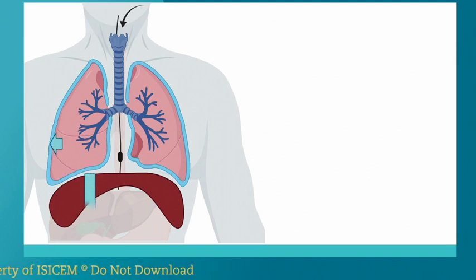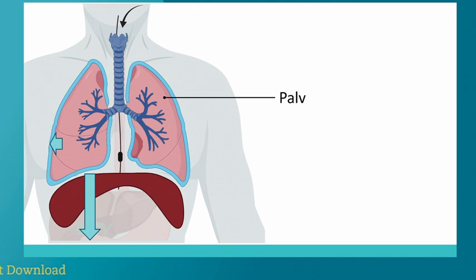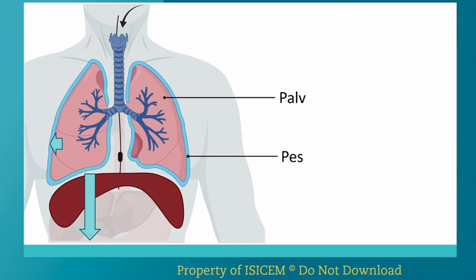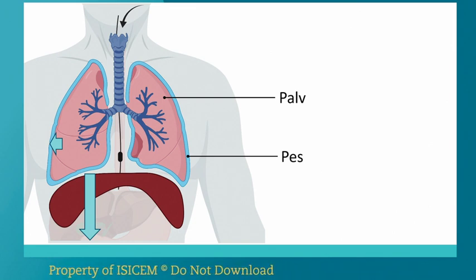So we're worried about lung distending pressure and the magnitude of respiratory effort. But when we measure plateau pressure, which we use as a surrogate of alveolar pressure, we're basically measuring the distending pressure to inflate the lungs and also the chest wall, without considering the magnitude of effort. The magnitude of effort is important because the pleural pressure, which gives us an idea of the respiratory effort in a patient breathing spontaneously, is not often measured in regular critical care. So what can we do?